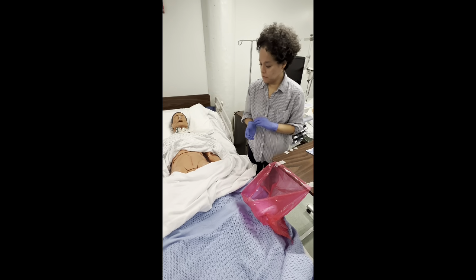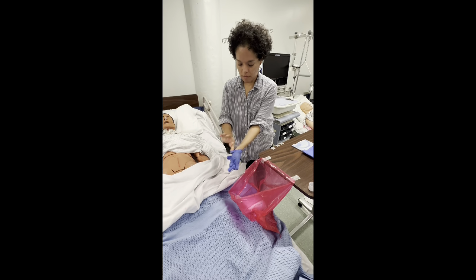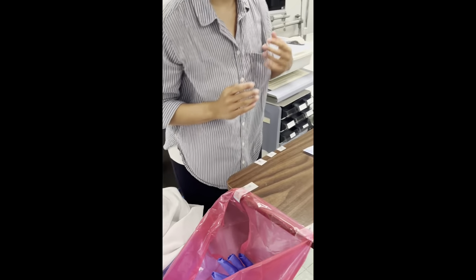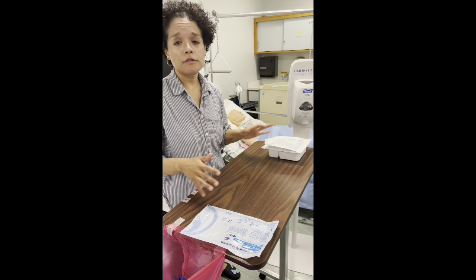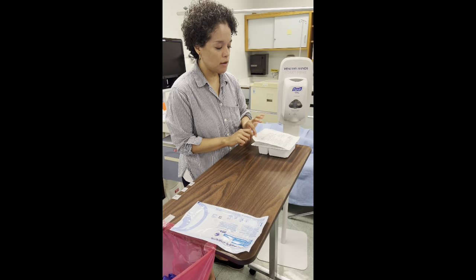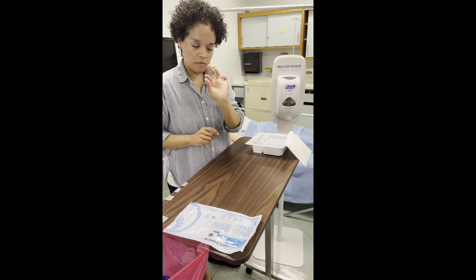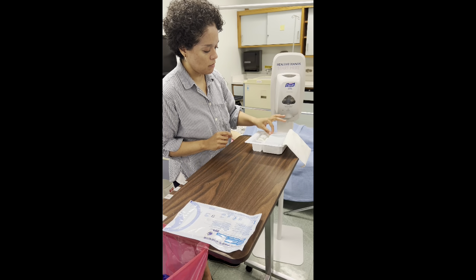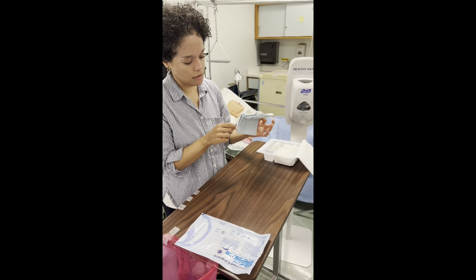Okay, so from here, I'm going to remove the gloves. Wash my hands. Now it's time for us to prepare our sterile field. So making sure you have a pinch at the end of this flap here. Open the kit away from your body. And using a pinch of your index and thumb, you're going to lift up the sterile pad. So this is going to be the under part of your sterile field.